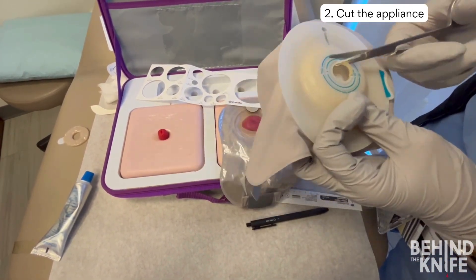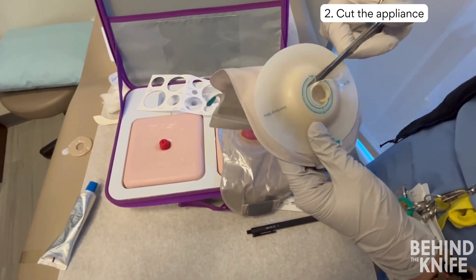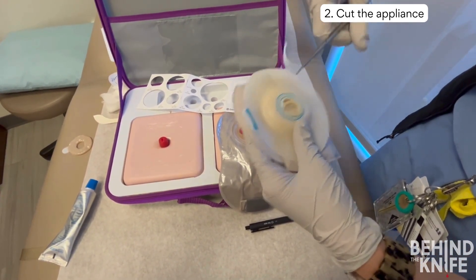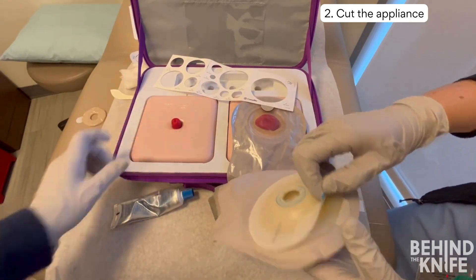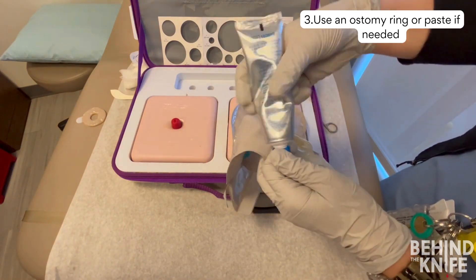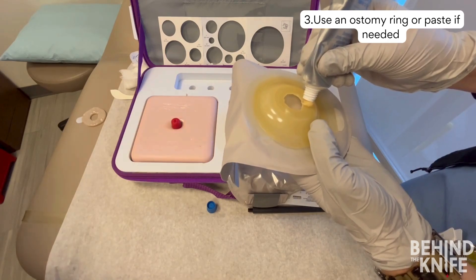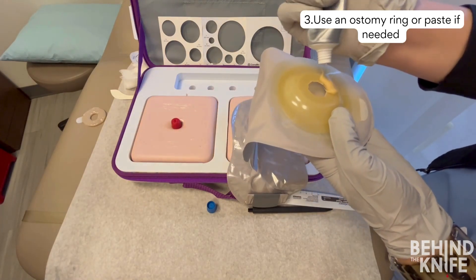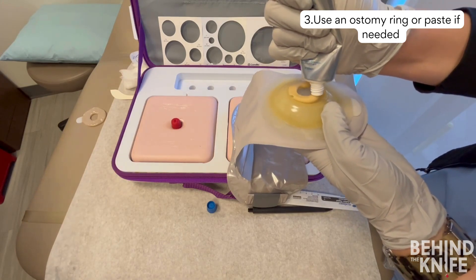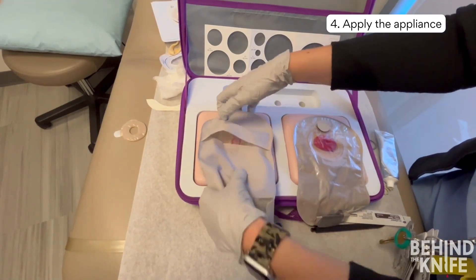It is helpful to err on the side of cutting a slightly larger hole in the appliance and using ostomy paste or an ostomy ring to make up the difference. Ostomy paste and rings are more pliable than the ostomy appliance, so they are able to stretch as the stoma gets pushed outside of the abdominal wall. Apply the appliance to the abdominal wall and check on the stoma. If you have the correct fit, the convex appliance should help the stoma protrude from the abdominal wall, which can decrease leakage and help with appliance adherence to the skin.